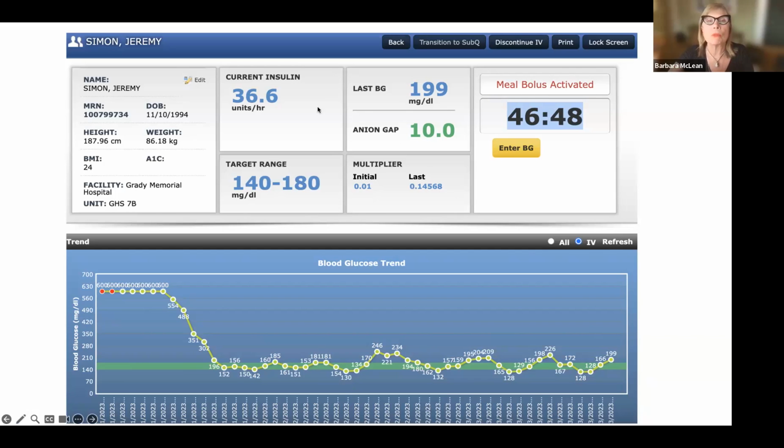And then when he eats, we're adjusting the insulin up. And that insulin adjustment upwards is based on the carbohydrate load that we're feeding the patient and the percent of the carbohydrates that the patient is eating. And try to make that as easy as possible. I tell all nurses, initially I defaulted it to 30 grams of carbohydrates, and then it's 0, 25, 50, 75, or 100% of the meal eaten. That actually tells Glucommander how to adjust in order to balance the insulin to the increase in carbohydrate. And then the insulin will be adjusted downwards in anticipation of the glucose slowly coming down. So just like your own insulin works, that's how meal adjustment works.